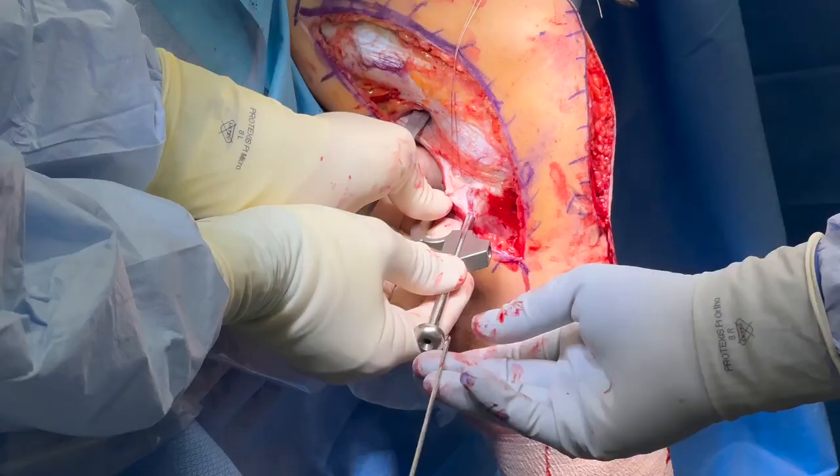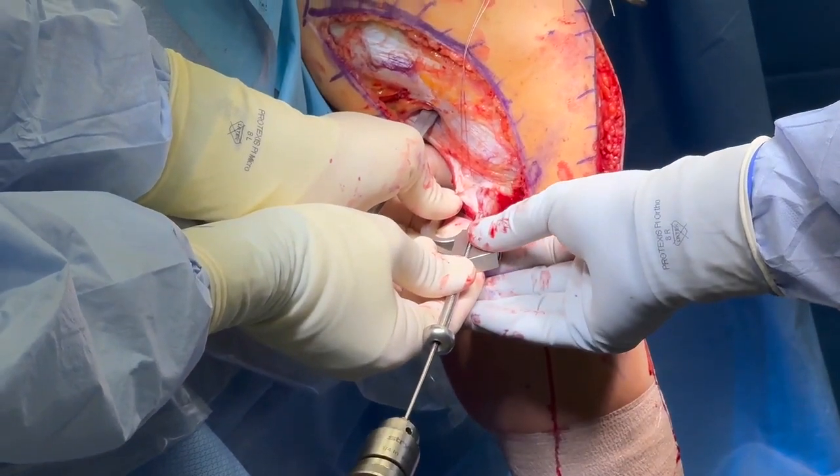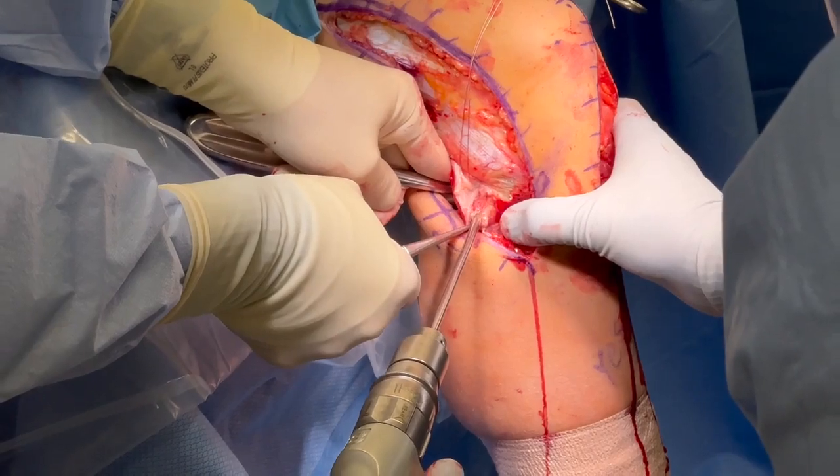A fibular head guide is used to drill a guide pin through the fibula that is over-reamed with a 6 millimeter reamer. A passing stitch is placed.